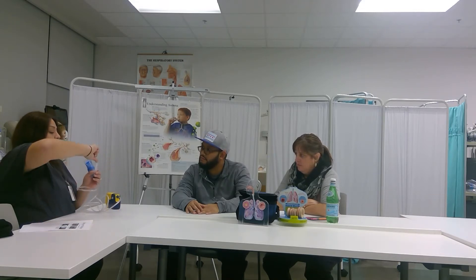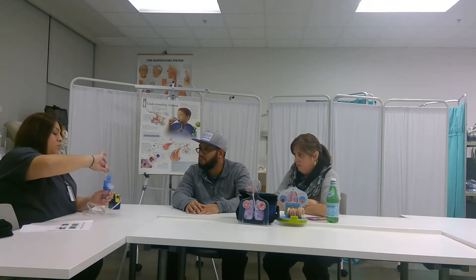The medicine the doctor prescribed for you is levalbuterol. It will be coming in a package and you would just rip one off and tear the top off. This opens and you squeeze the contents of the small vial in here. Throw that away and then close this. The compressor has an on/off button here — turn it on and you should hear it. When you hear that, make sure that mist is coming out of the stem. That's how you know it's working properly.